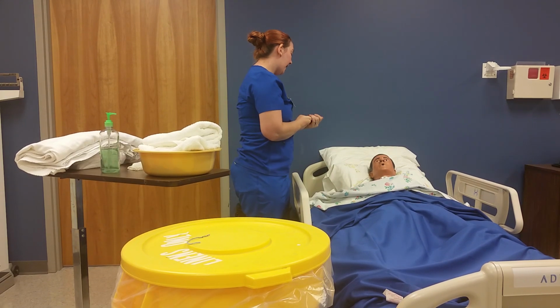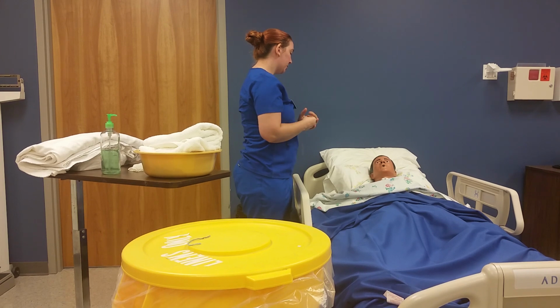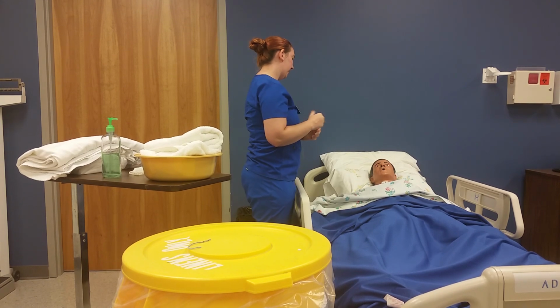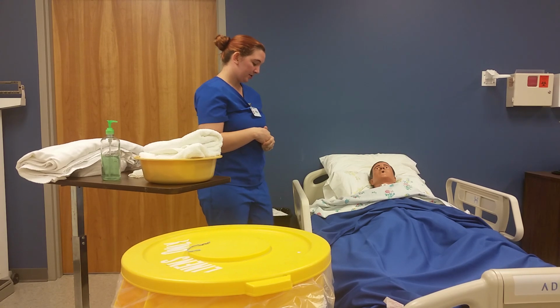Your doctor's ordered a catheter today to ease some of the urinary retention. We're going to place that in. It's going to be a tube that goes into your bladder. We'll fill the balloon up with some water to keep it in place, and it's going to allow the urine to drain into a bag. This will help ease some of that discomfort, okay? If he has any questions, he could ask those at this time.